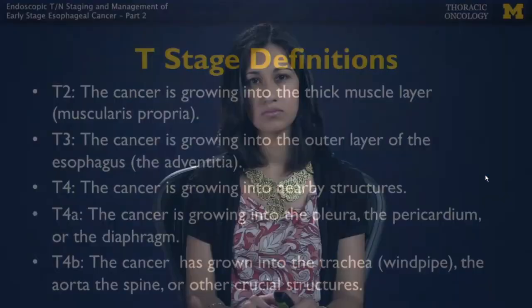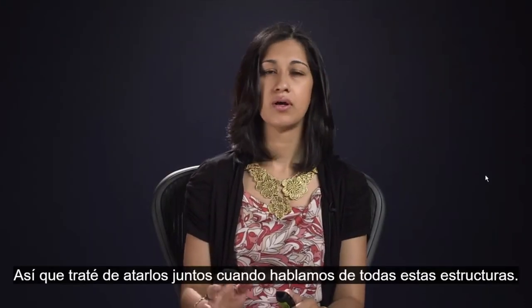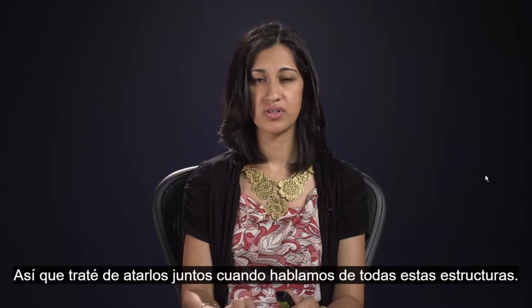So let's try to tie this together when we're talking about all of these structures, and then I'm showing you something on an echo endoscope.